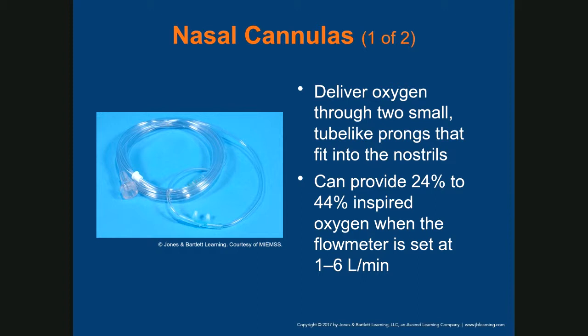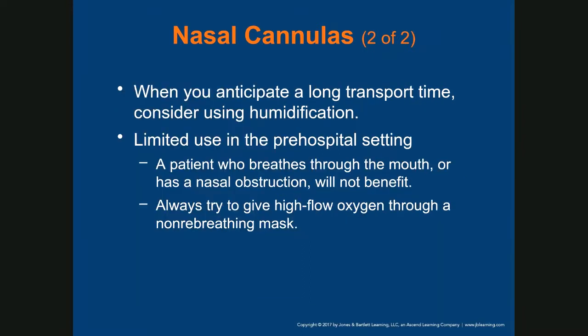If you have to give the patient oxygen therapy over an extended period of time, ensure that the oxygen is humidified, right? And make sure that the humidifier is clean, right? Don't keep it on the oxygen cylinder for days or weeks or months. That's not good for the patient, right? So a humidifier should be changed between each patient, or on each shift you need to clean the humidifier.